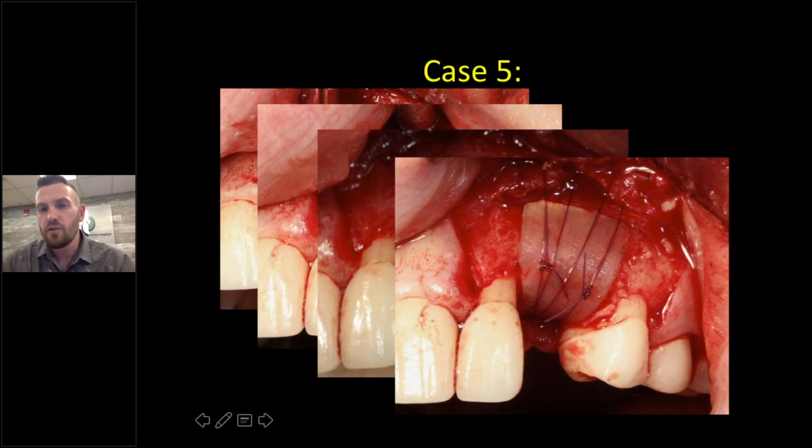Vinay, do you ever use another membrane like BioExclude adjunctively over the top of the laminar bone sheet to enhance soft tissue healing? Really, I use a lot of connective tissue, and again, like I said, PRF. I would say that your soft tissue healing is probably going to be better from a biological aspect if you use soft tissue to let it heal. The BioExclude itself is going to add a nice barrier to bacteria, and might improve some of your soft tissue, but really I don't think the BioExclude is going to help with your soft tissue healing, or increasing your soft tissue. It may help it heal better, but to answer your question, no, I do not.